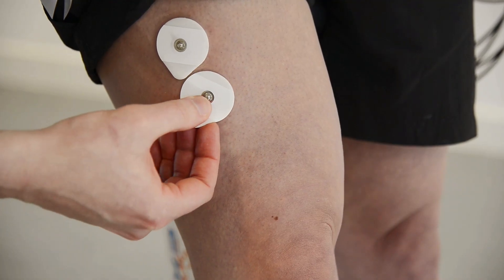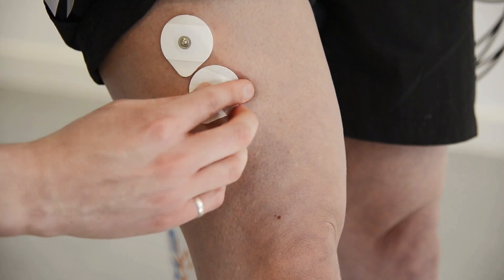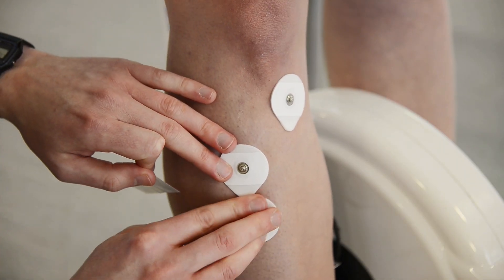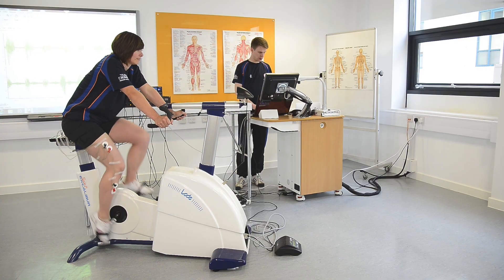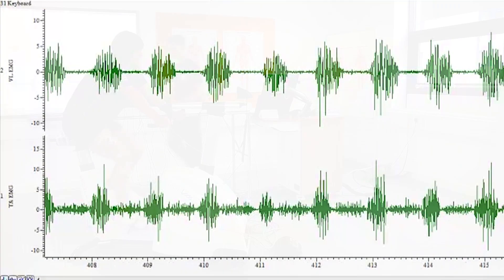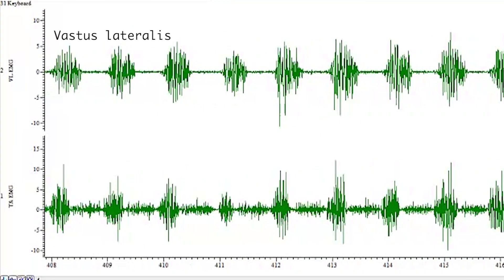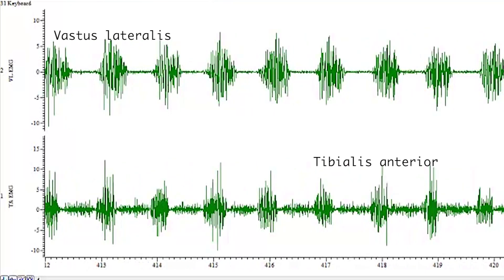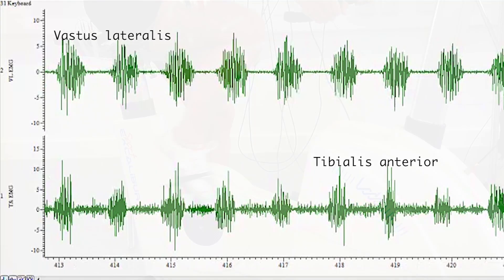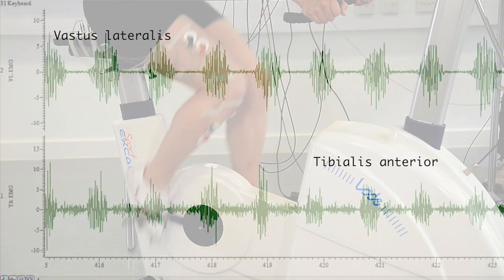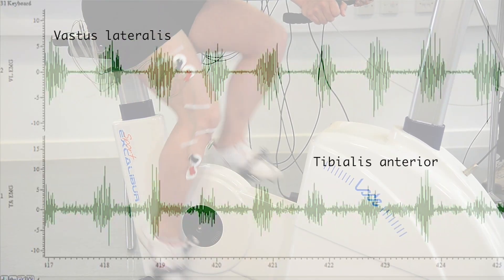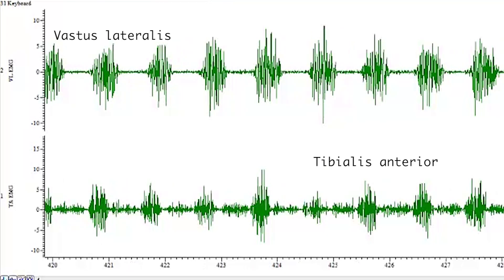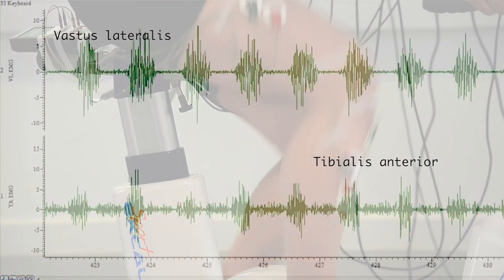In sport and exercise, it is common to use EMG to identify precisely when a specific muscle is activated during a particular movement. For example, here we are recording muscle activity from the vastus lateralis and tibialis anterior muscles as Amy is cycling. The EMG shows that the vastus lateralis is active during the downward phase of the pedal cycle, in order to extend the leg and push down the pedal.